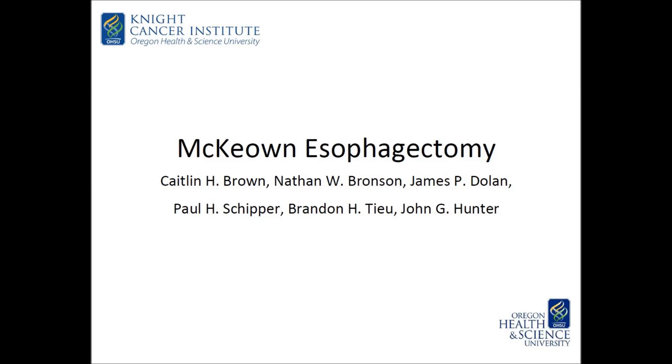McKeown esophagectomy is the preferred approach for locally advanced esophageal carcinomas in many centers. In this video, we will show the technique utilized at Oregon Health and Science University for patients with mid and distal esophageal cancers.